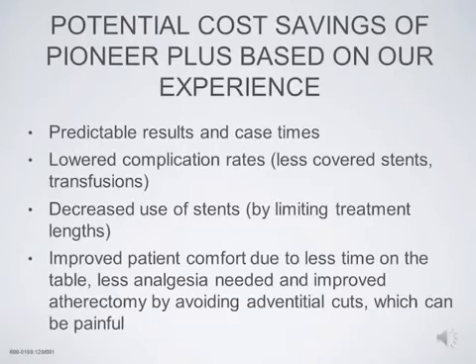Decrease use of stents by limiting the treatment lengths, and certainly if you do need to stent, limiting the aspect where you have to go into distal segments such as popliteal. And improve patient comfort due to less time on the table, less analgesics needed, and improved atherectomy by avoiding adventitial cuts, which certainly can be painful, which we see with virtually almost all atherectomy catheters when the catheter becomes sub-adventitial.